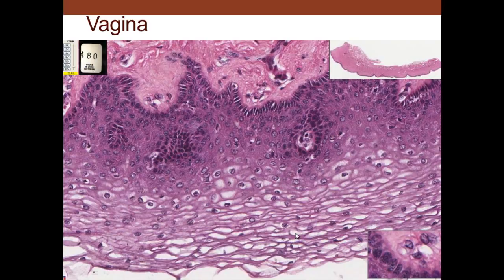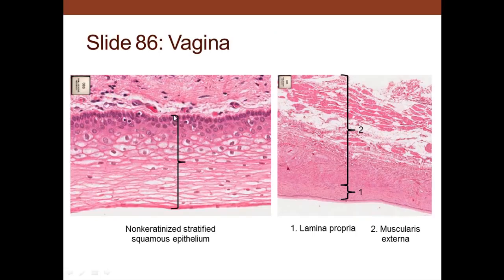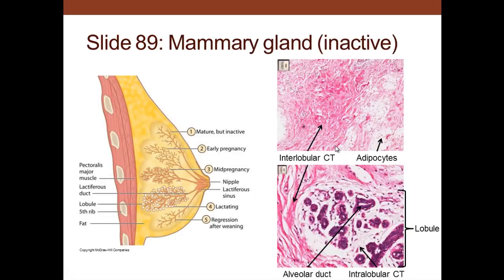Here we can see the basal layer, the spinosum layer, and then the stratum corneum layer, but it's not keratinized — you just have flattened cells, some of which still have nuclei on the surface. We see simple columnar epithelium cells — the mucous glands of the endocervix — and then on the outer side, non-keratinized stratified squamous epithelium of the vagina, along with the lamina propria and the muscularis layer. Now if we look at the mammary gland, we can see this inactive slide.